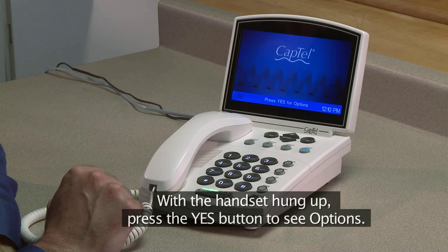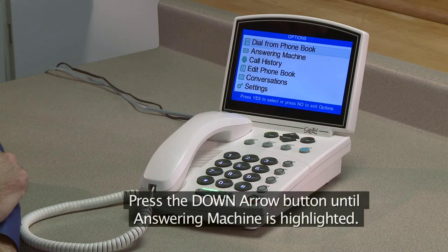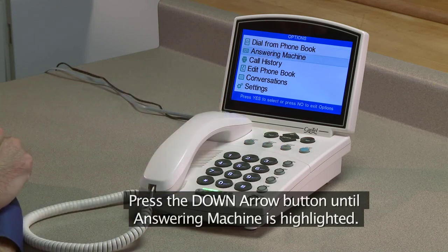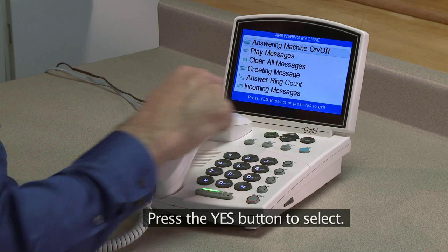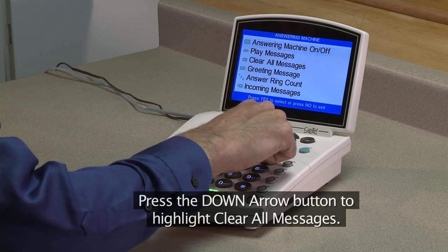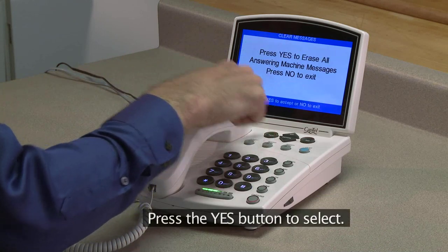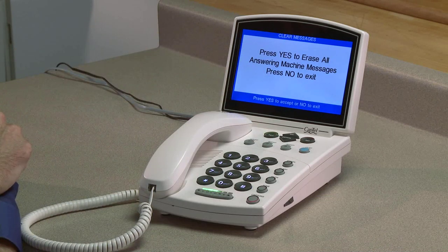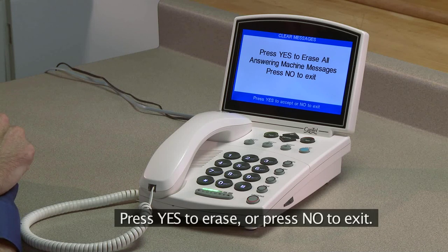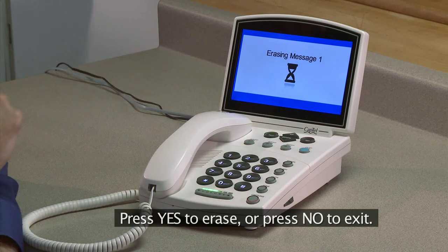With the handset hung up, press the Yes button to see options. Press the down arrow button until Answering Machine is highlighted. Press the Yes button to select. Press the down arrow button to highlight Clear All Messages. Press the Yes button to select. CapTel asks if you want to erase all the messages. Press Yes to erase or press No to exit.